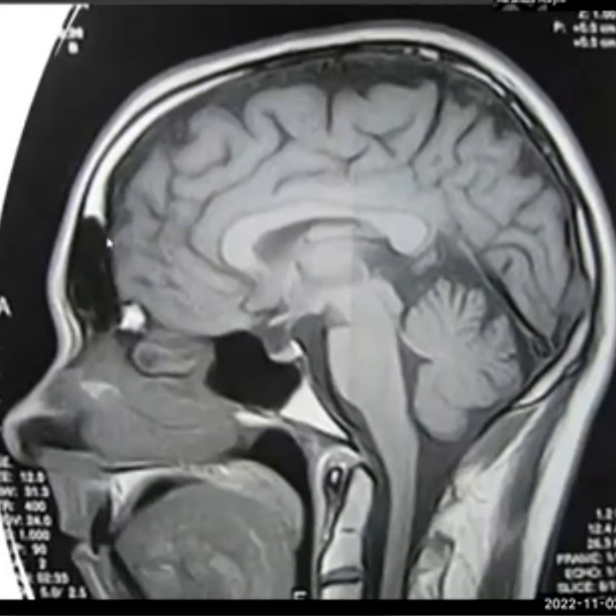Let's move to the coronal brain sequence. So I will be dividing the brain into anterior and posterior portions, so it is front and back. My slice angulation for the coronal brain scan will be parallel to the brainstem on the sagittal image again.